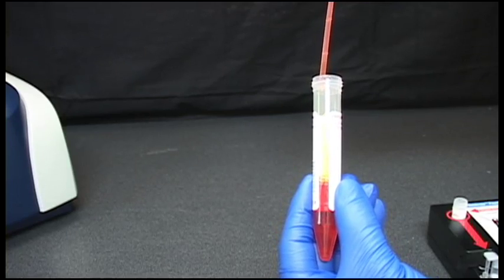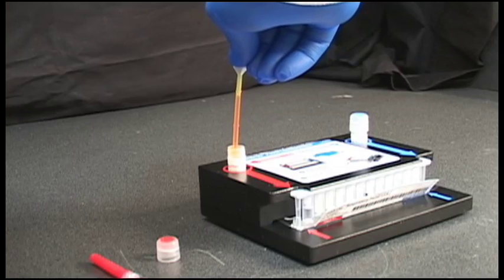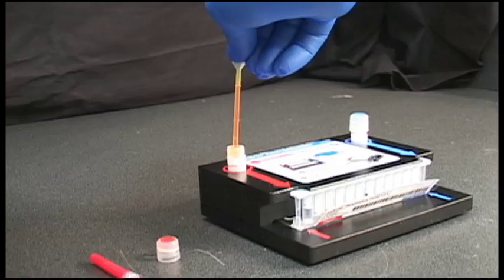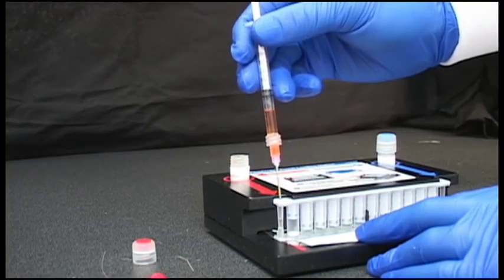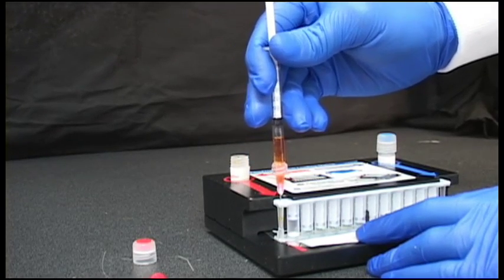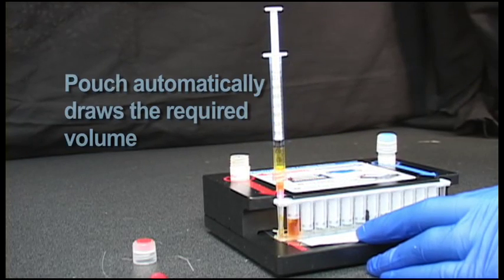Next, sample is added to the FilmArray sample buffer. This solution is then mixed and injected into the FilmArray pouch through the red inlet port located on the left side of the pouch. Again, the vacuum in the pouch automatically draws the required volume.